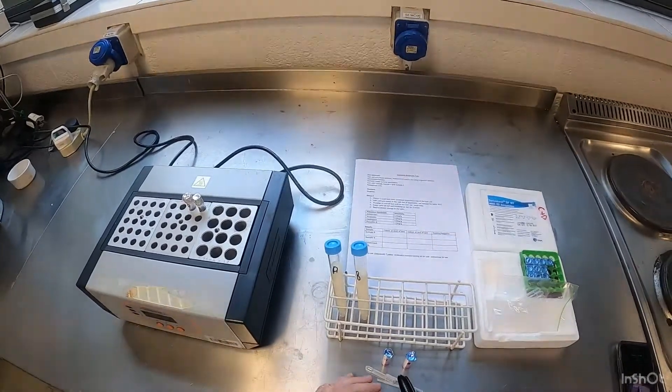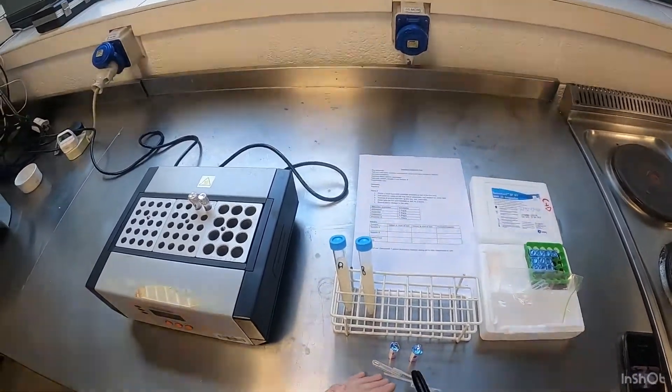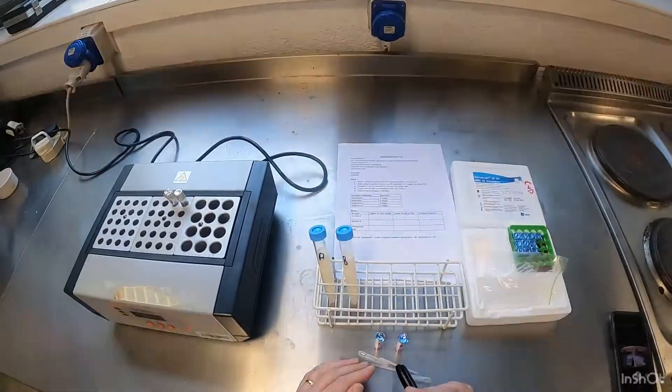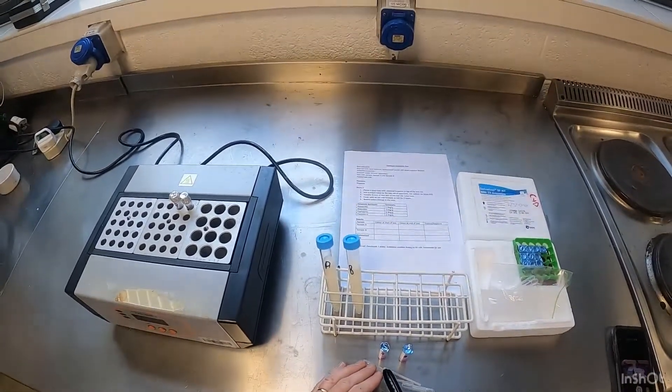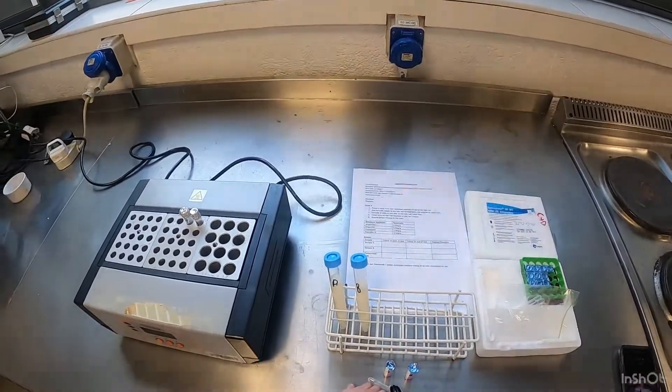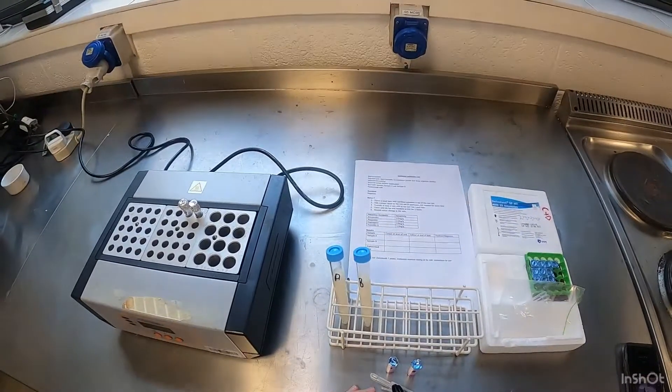If the colour is yellow, that means the bacteria had a chance to grow and there's no antibiotics. If the sample remains purple in colour, that means there was an antibiotic present because the bacteria did not get a chance to grow.